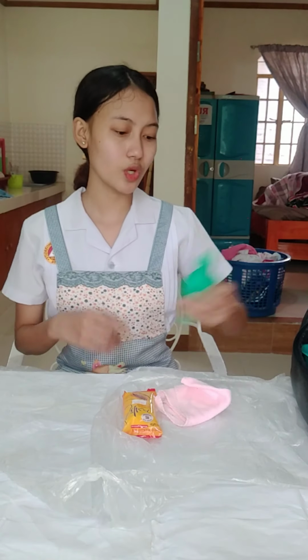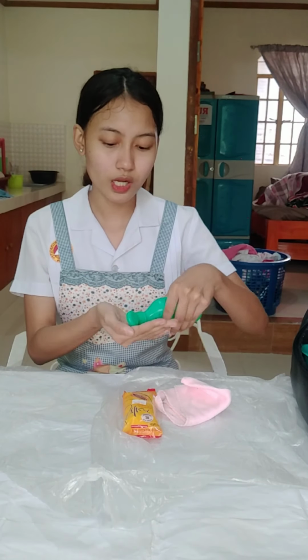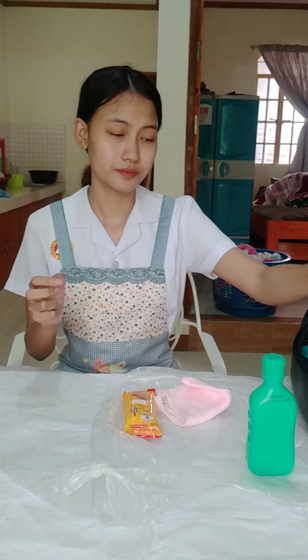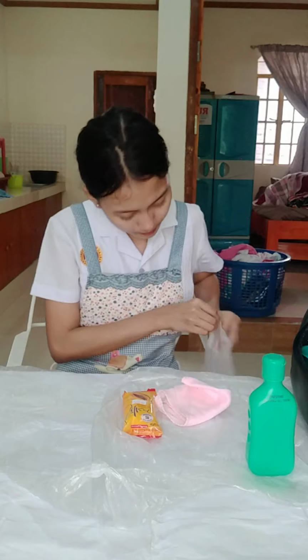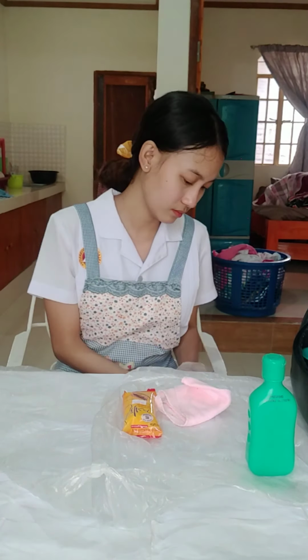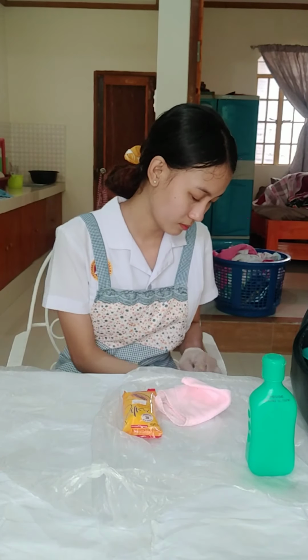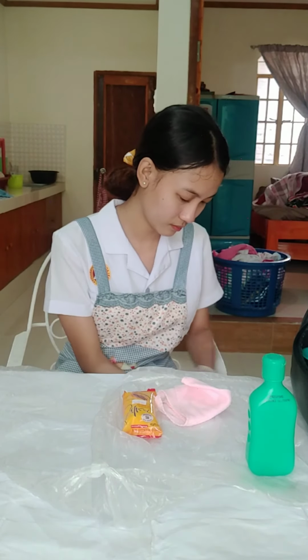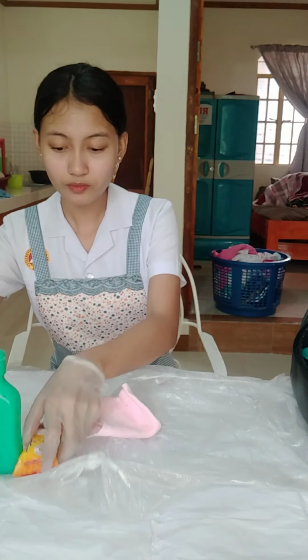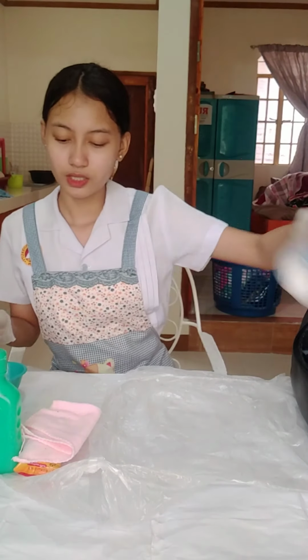And then after that, I am going to wear my gloves. First, I need to perform hand hygiene again to remove all the microorganisms. After that, I will take out the kidney basin and also the cotton balls with alcohol. So I will put the cotton balls with alcohol here.